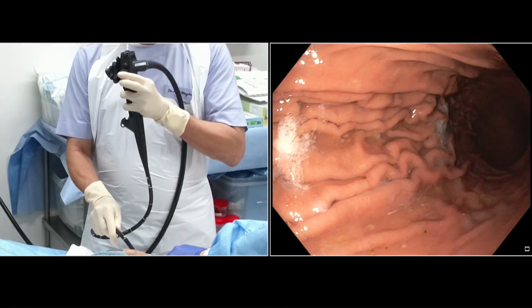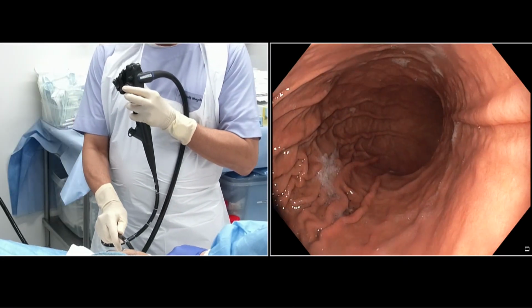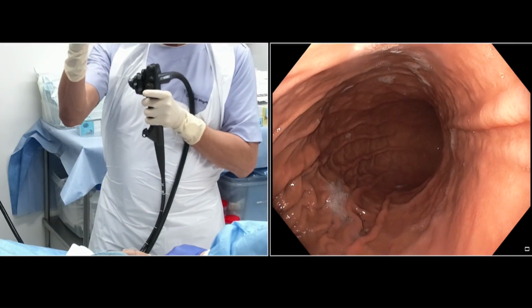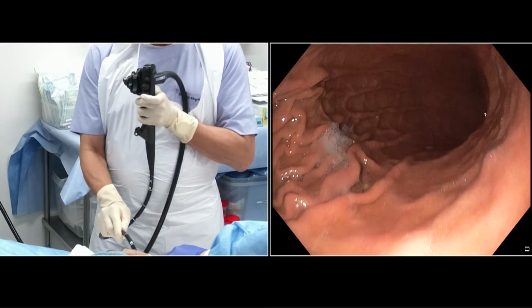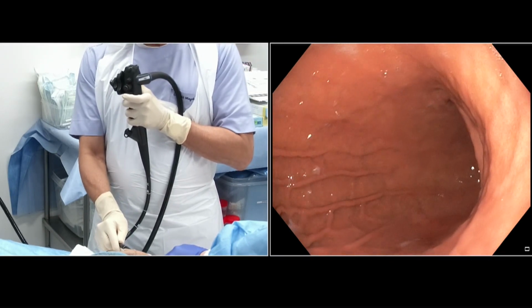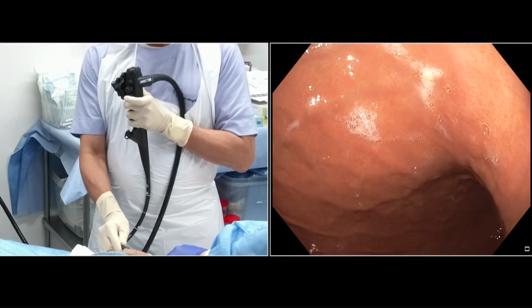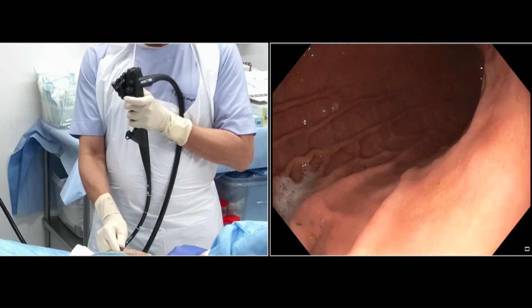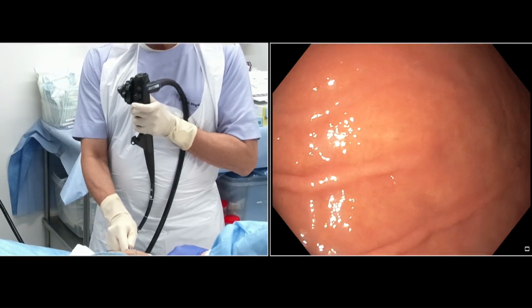I am slowly turning the shaft of the scope to the right and my body to the right. So automatically now the scope has got oriented towards the antrum of the stomach, and I am going along the greater curvature of the stomach. Now if you see the stomach here, on the right side is the lesser curvature, left side is the greater curvature, above here is the anterior wall, below here is the posterior wall. So now I am going along the greater curvature, go here, go here.